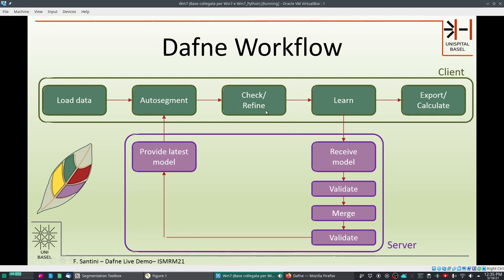Once you've done this check and refinement, Daphne will learn from the modifications you've made to the proposed auto-segmented masks. You can then export your images or calculate some statistics, and at the same time the improved model is sent to the server. On the server, the received model is validated against curated data and merged with the existing model. The final model is validated again to ensure performance is within acceptable limits, then made available for your next iteration so you can perform an improved segmentation on new data.